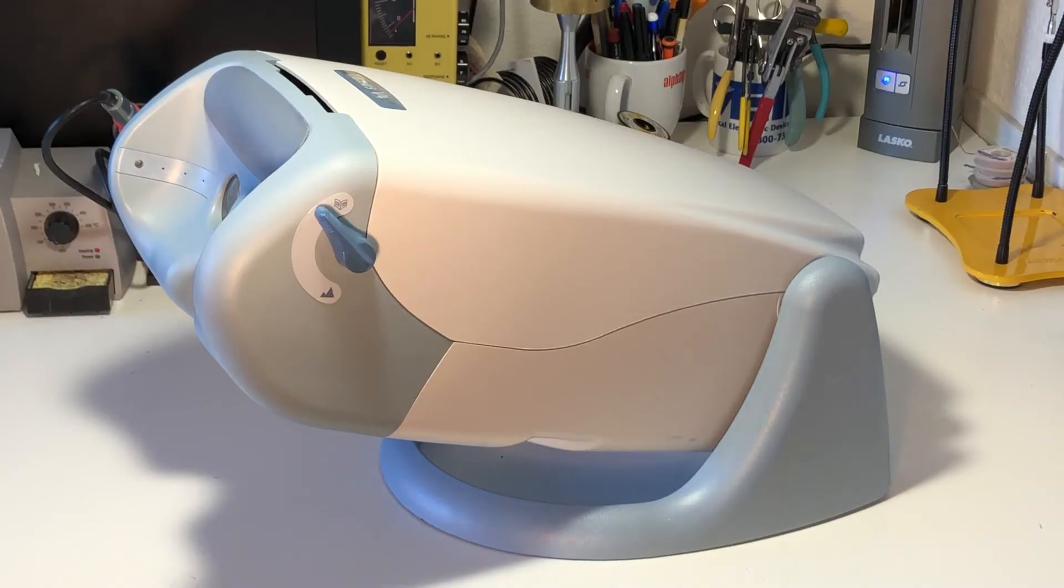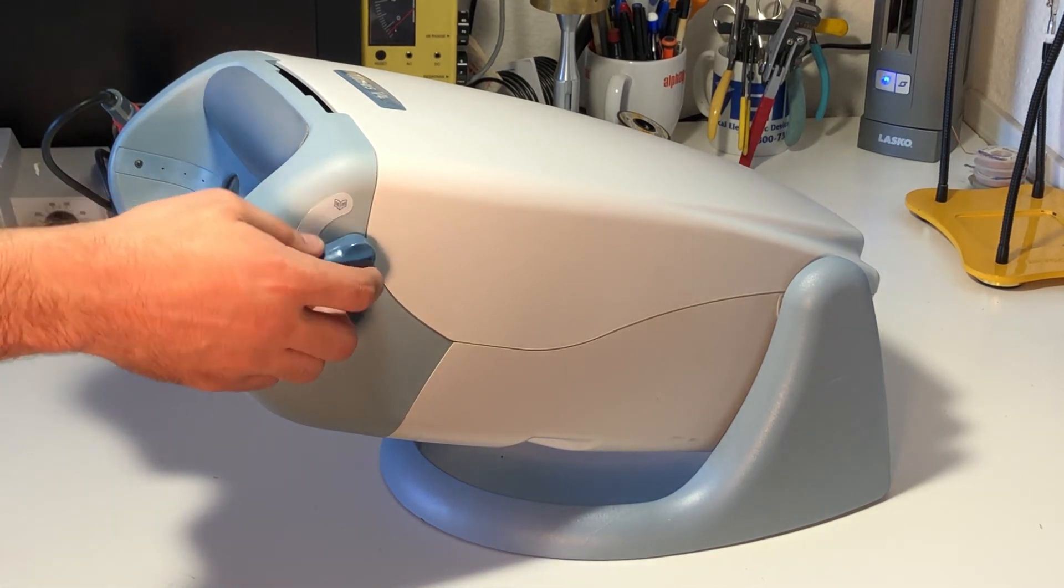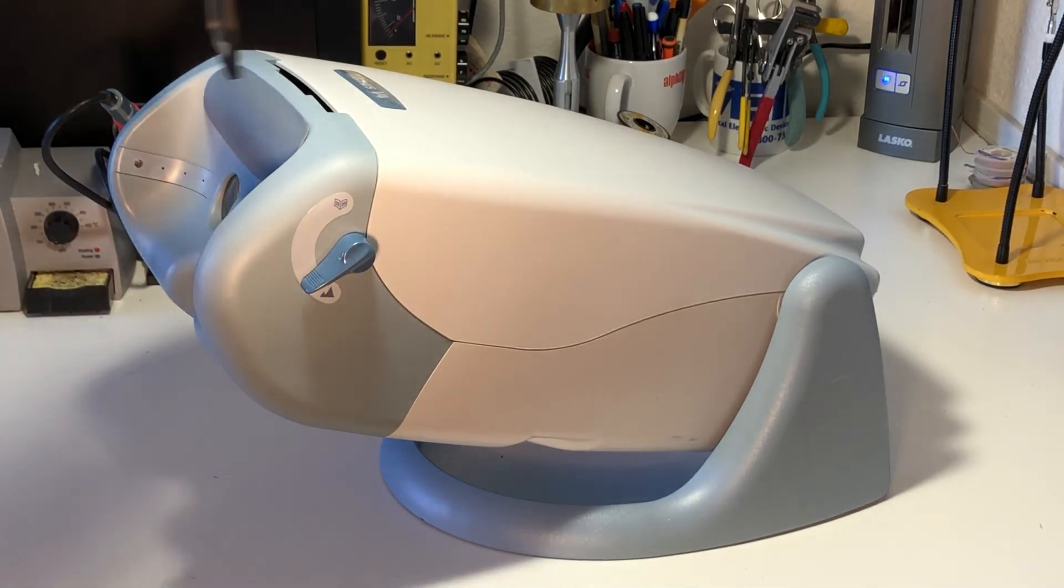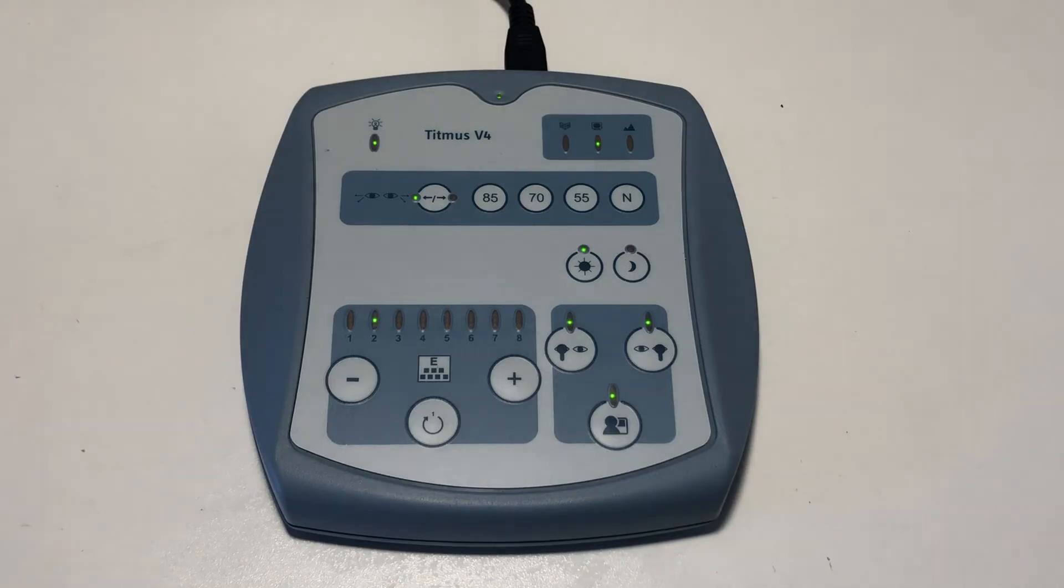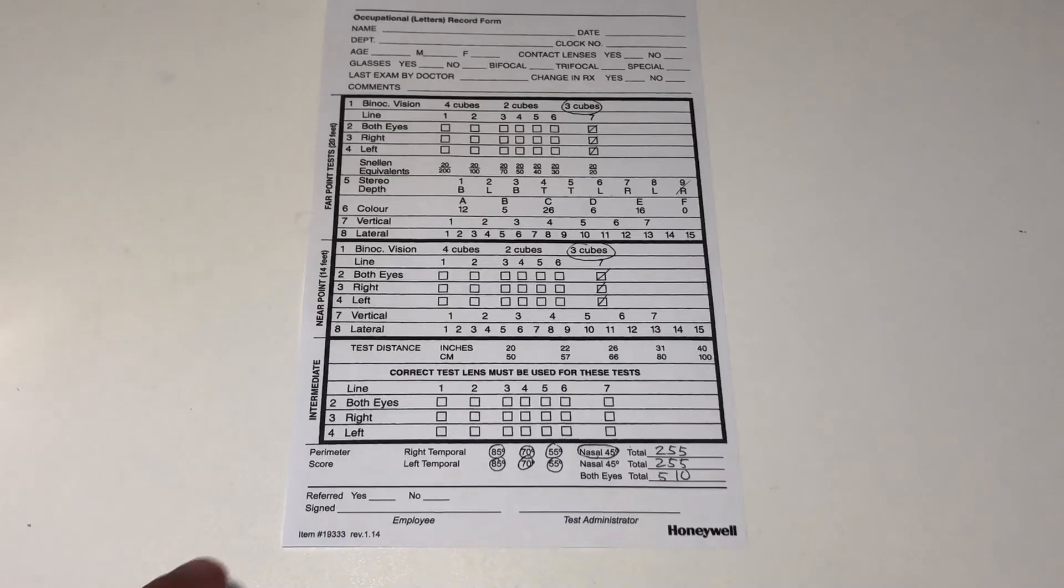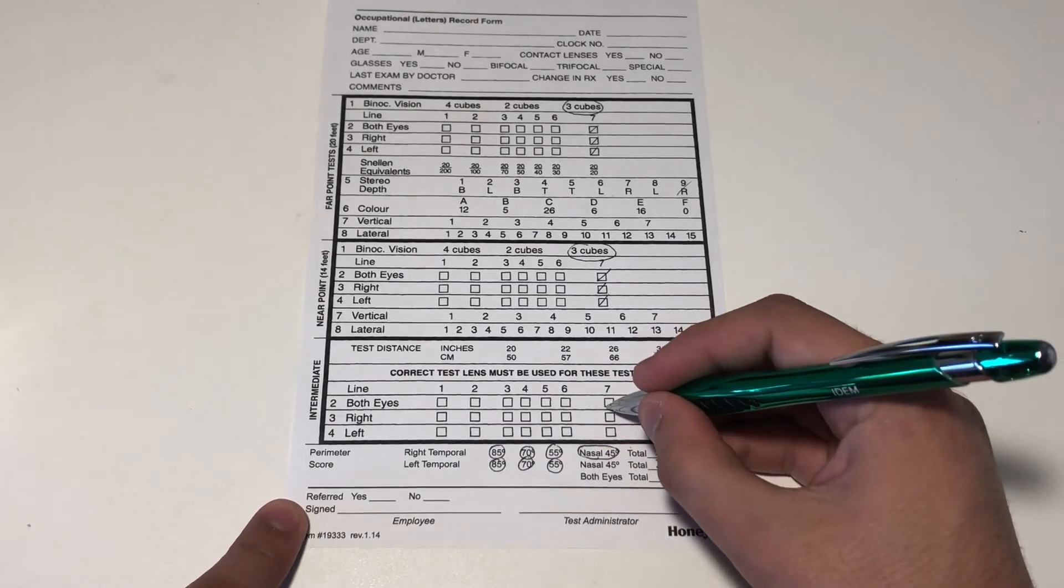Change the near far lever to the far position and slide the intermediate lens into the vision screener. Now repeat slides 2, 3, and 4. Record the results in the intermediate section of the record form.